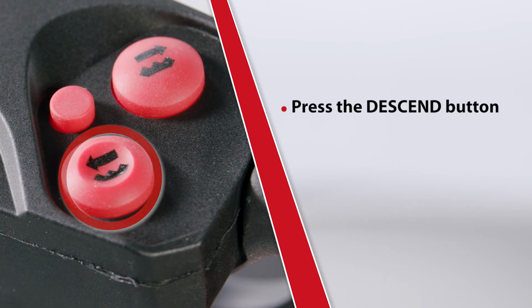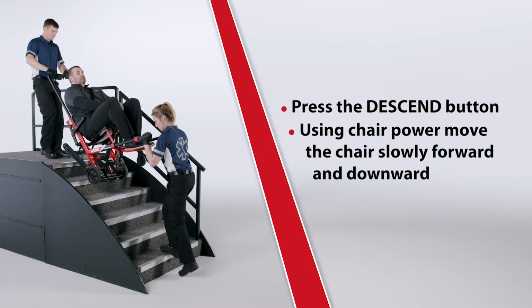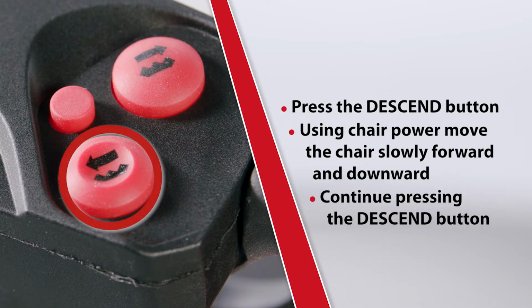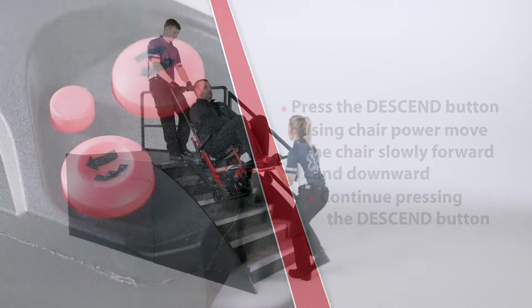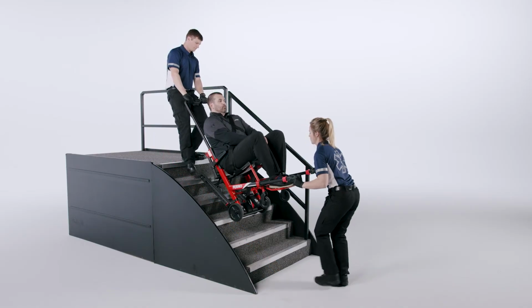Press the descend button and using the chair power, move the chair slowly forward and downward until the tracks engage 2 or 3 steps. The operator should continue pressing the descend button. Move the chair in a straight line, allowing the motor to do the work.